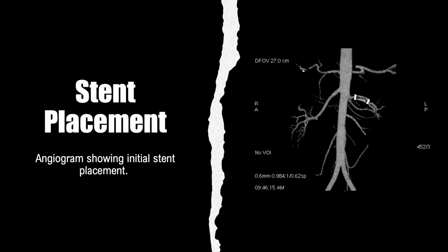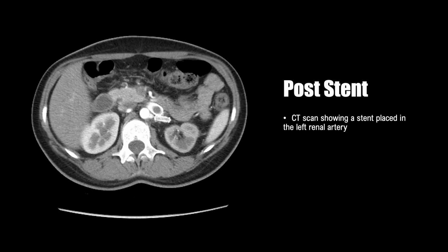Here's a stent that was placed for that 24-year-old female. This is an angiogram showing initial stent placement. Here you can see where the stent has been placed. This is also another image of a CT showing where the stent has been placed.